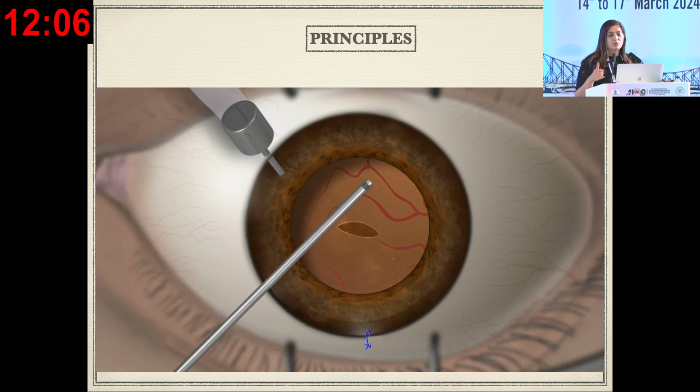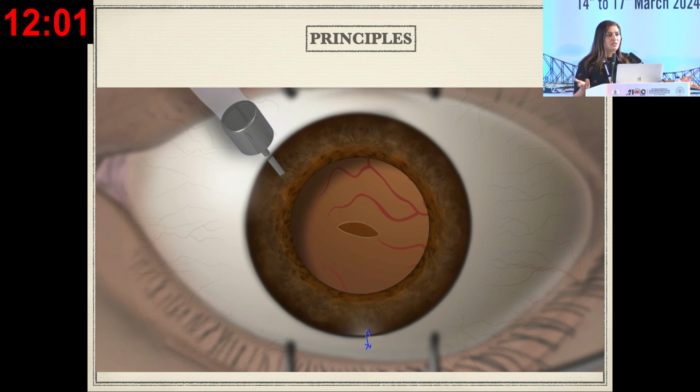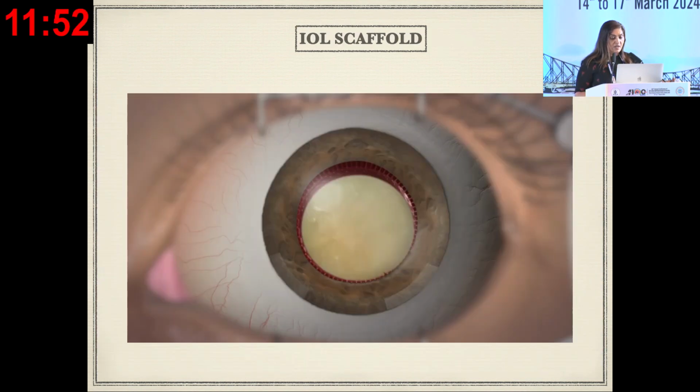Always stain using triamcinolone, because when you stain with triamcinolone, you see the unseen things that are there. You see the vitreous much more clearly, and any minute strand gets defined very well. So this is just an animation.